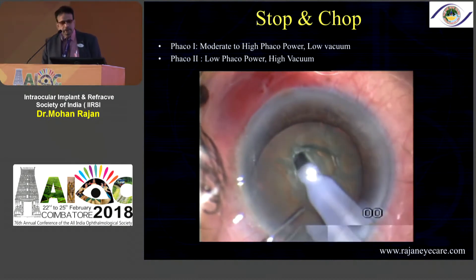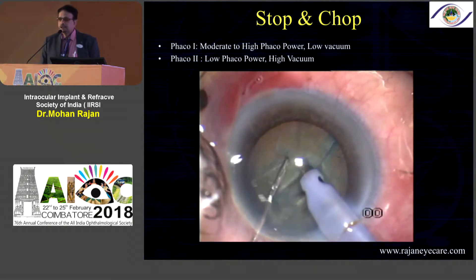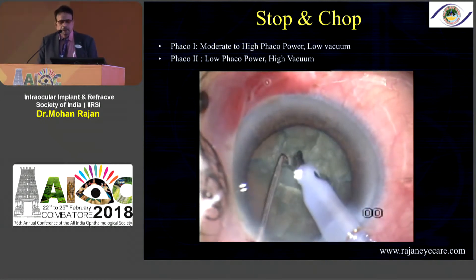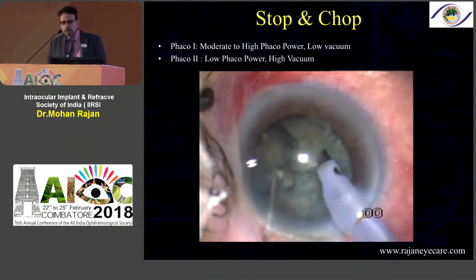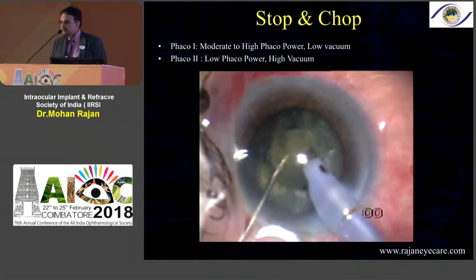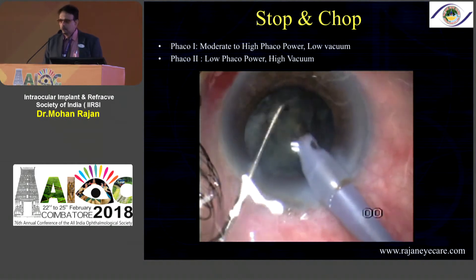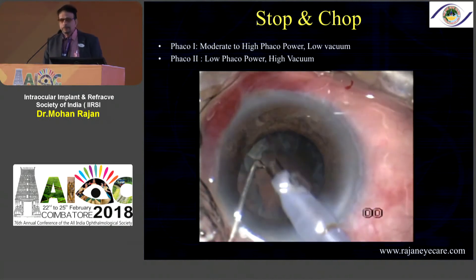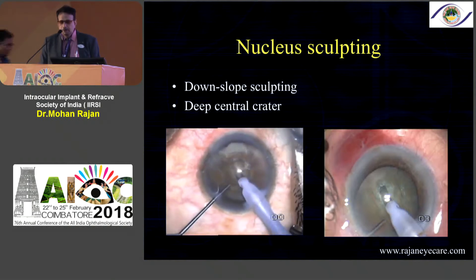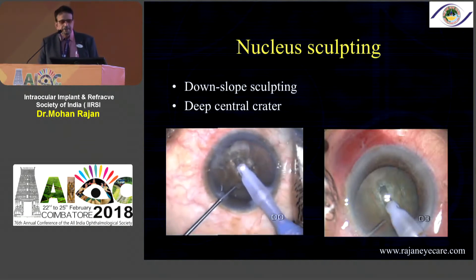For a little harder cataract we can do what is called stop and chop. You make a deep trench in the center and then chop each half — crack the cataract into two halves. When you do a trench use high FACO power; when you do chopping use low FACO power. You can go into regular pulse or hyper pulse depending on your machine. All machines are now coming with micro pulse or hyper pulse, which is part of the cold FACO technology. Once you chop each half you need a chopper — it can be blunt or sharp, it doesn't make a difference. Stop and chop is very reproducible in all grades of cataract; the key is that deep trench in the center.